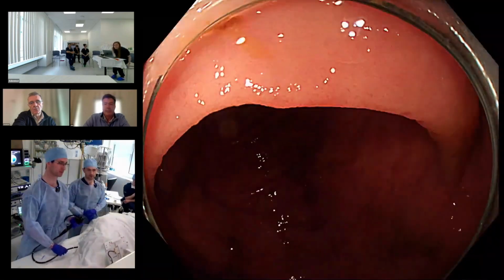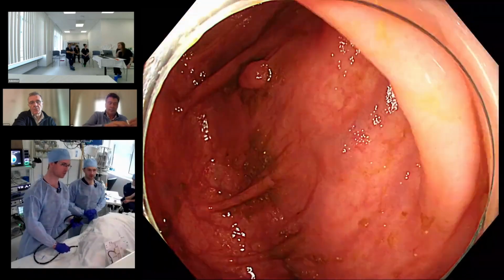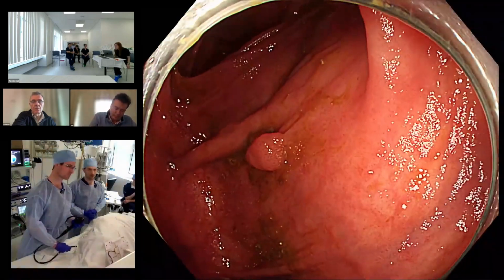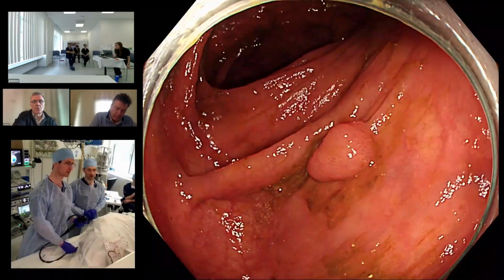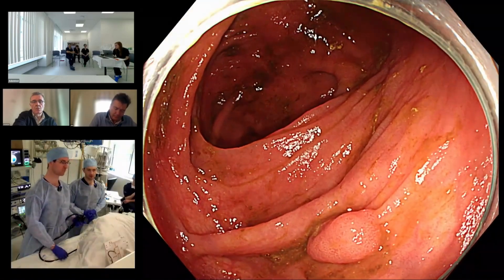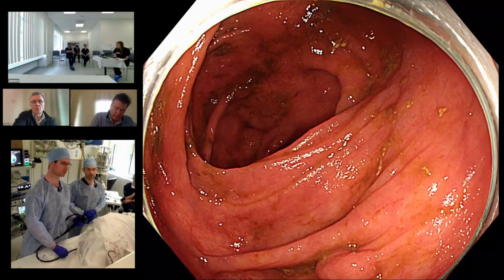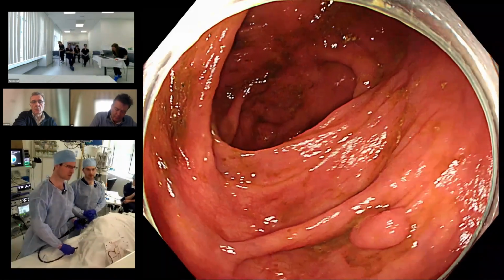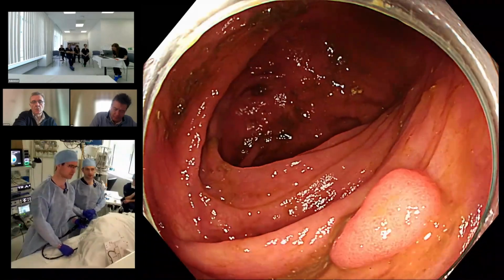So we are in the mid transverse, approaching proximal transverse colon. Is this one of the 3? Yeah, this is the middle one. Okay. And there is one more 2 folds proximal to this that is half the size, I guess, or a little smaller than this one.